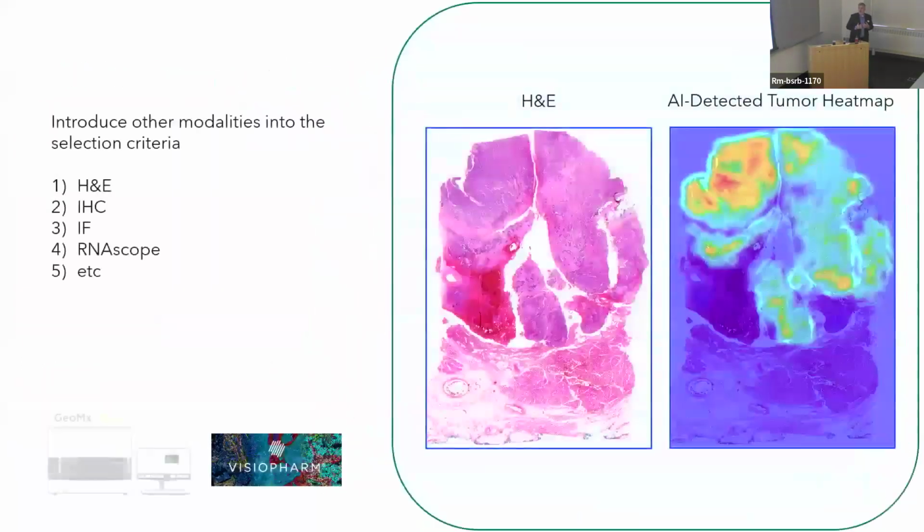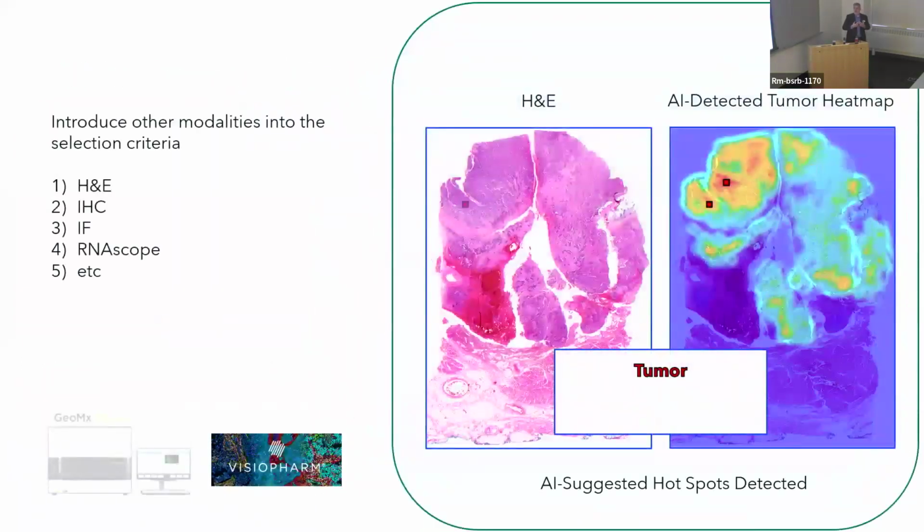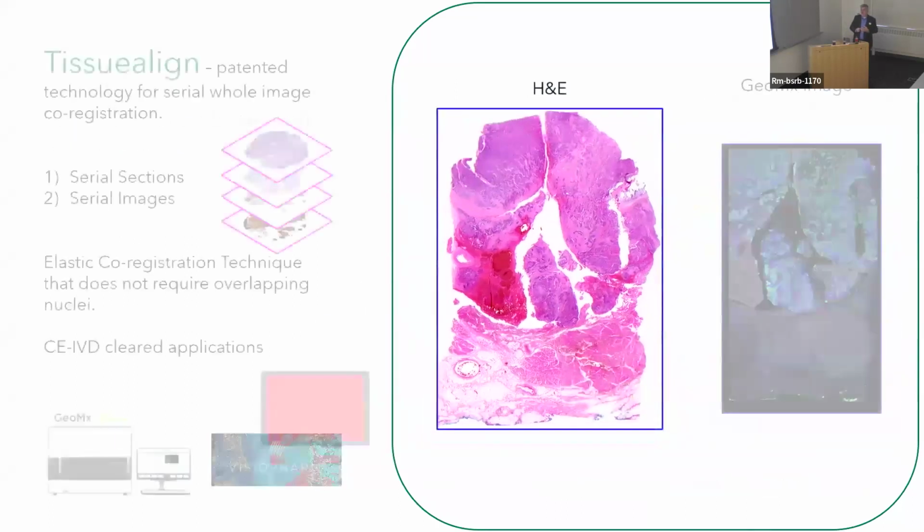We've also wanted to introduce the ability of using H&E in the genomics space. So it creates a beautiful fluorescence image, but a lot of pathology and everything happens in H&E. A lot of that morphological investigation happens in that H&E space, and it can be pretty hard.